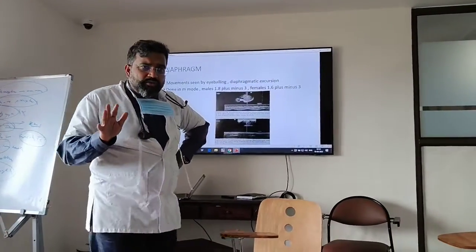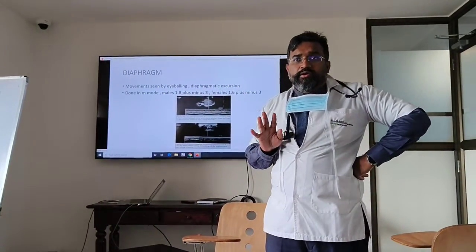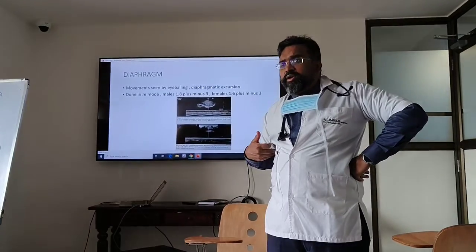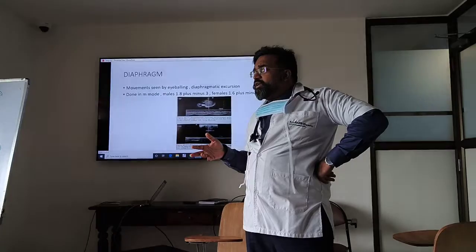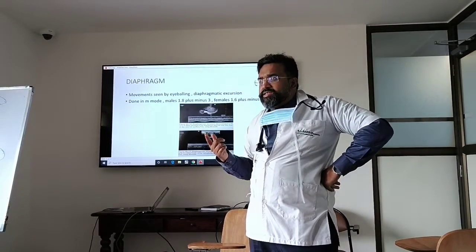So diaphragmatic ultrasound should be done very carefully. And you have now a patient in which you can do it. Otherwise you can do it in other patients also. There are normal patients you can actually look at. Are you understanding?